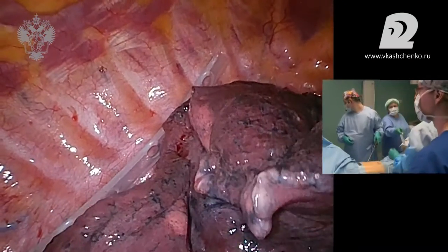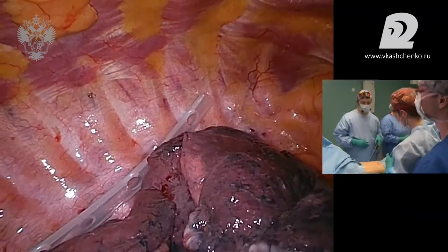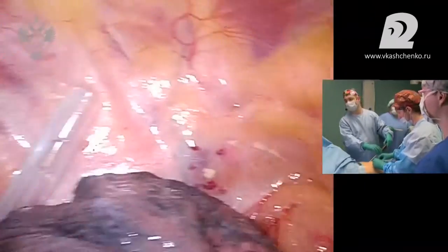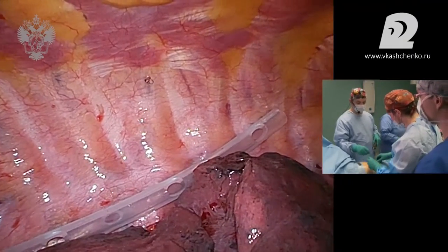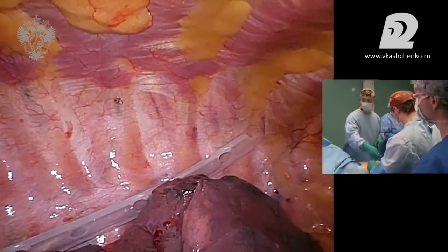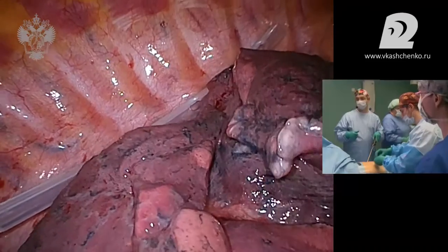This is drainage installed, and even being quite far away from thoracic surgery, it's clear. The abdominal stage, of course, Alexei Mikhailovich Karachun has just come here. He has had half a cup of coffee, and he will continue with the abdominal stage.